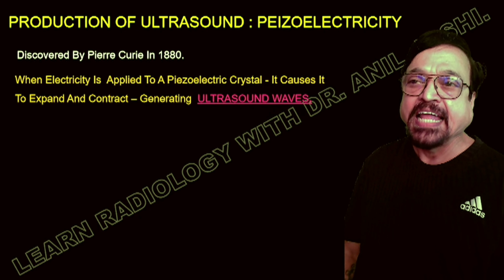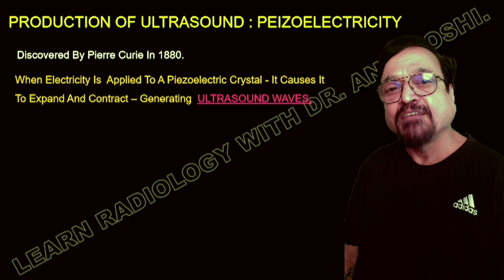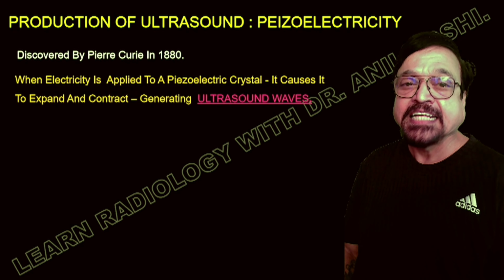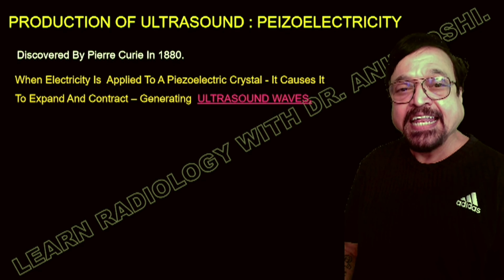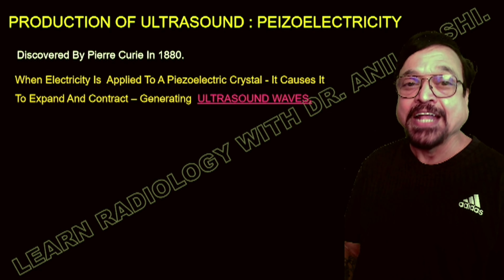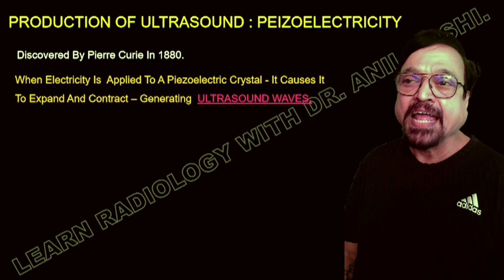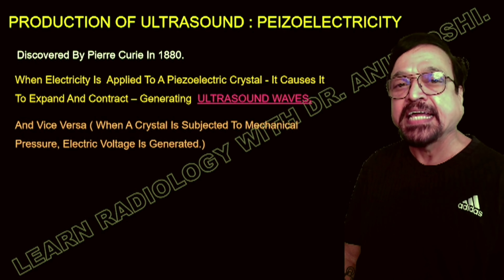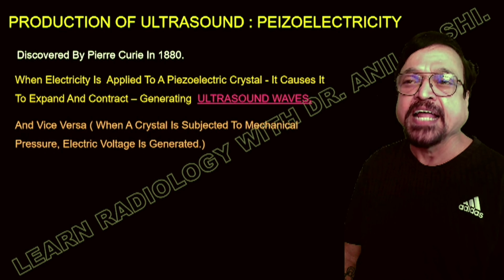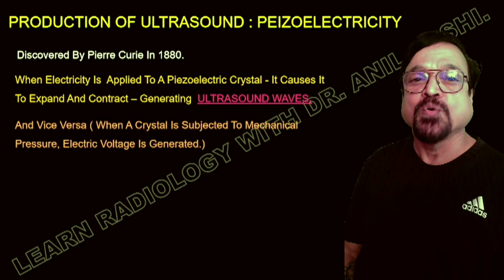Now, when electricity is applied to the piezoelectric crystal, it causes it to expand and contract. That is a vibration. Electric energy sets a quartz into vibration, and then electricity is converted into an ultrasound wave by a phenomenon called the piezoelectric effect, and the crystals which have these unique characteristics are called piezoelectric crystals. They are capable of vice versa also.